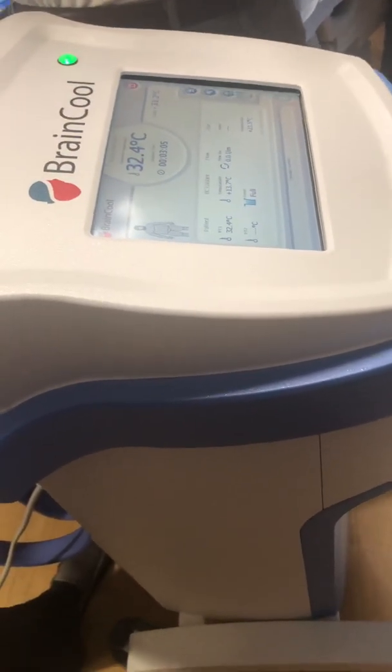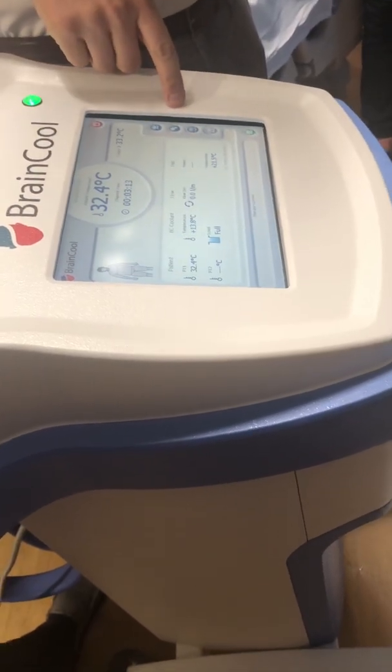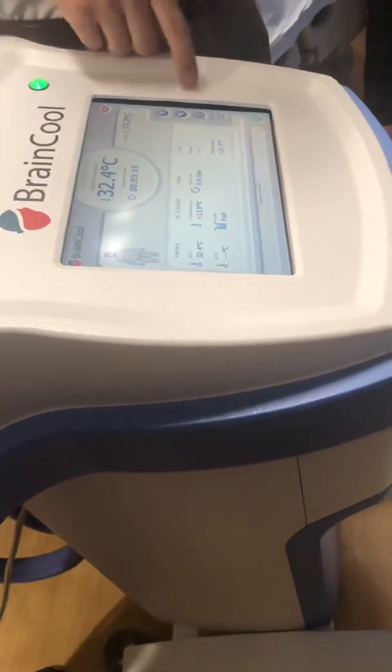That's what I really want our staff to understand, that piece of it. Pad power goes up, because the water goes cold, which means they're fighting it. I need to do something about it. That's your intervention. So what will pad power normally sit at?